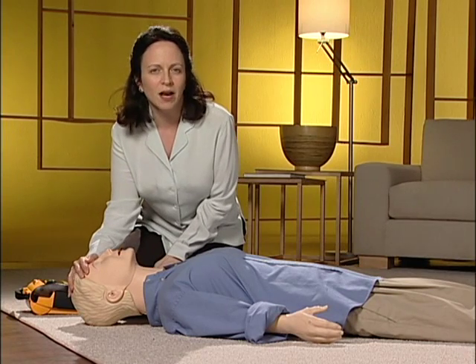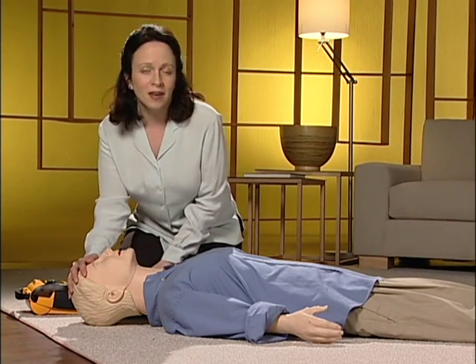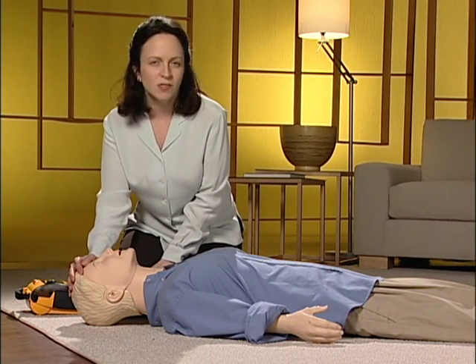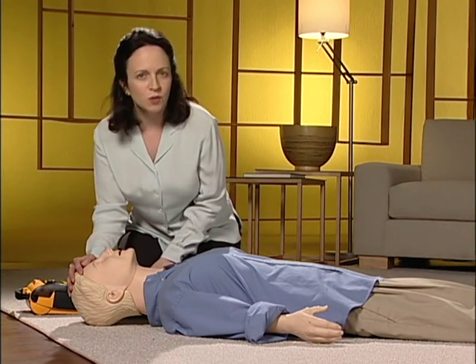A person in cardiac arrest either does not breathe at all or has abnormal breathing. And again, abnormal breathing might be gasping or snoring breaths. If they're still not responding and you don't see or feel normal breathing, give 2 breaths.